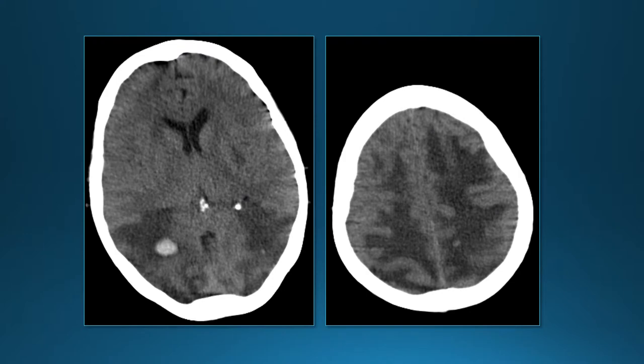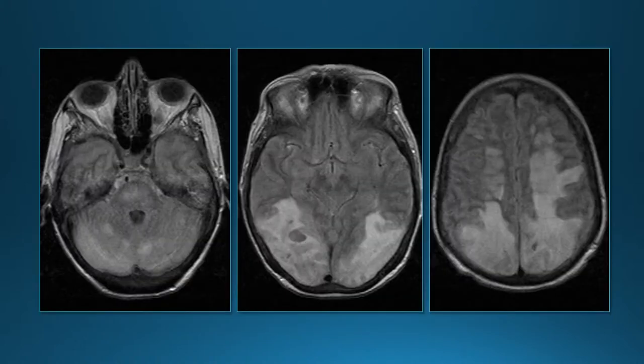Head CT shows extensive hypodensity in the subcortical white matter, with a focal area of hemorrhage. MRI FLAIR images show extensive hyperintense signal in subcortical white matter, also gray matter, tending to involve the posterior parts of the brain and posterior fossa.